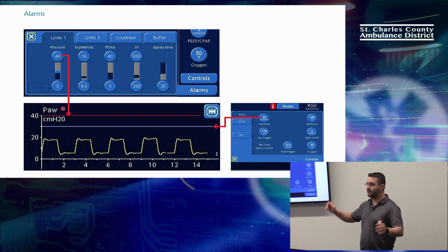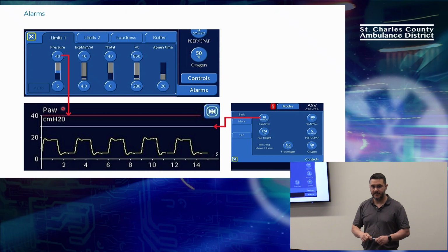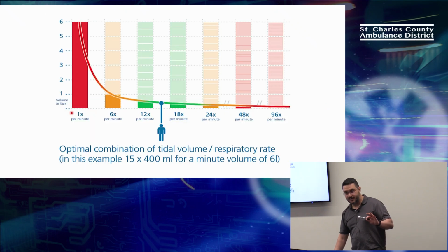And you're going to have to dust off the stuff that we covered a second ago and really program a ventilator, okay? So if the machine cannot give you the tidal volume that you want by getting to here, and it gets to here and it can't do that, that's when the machine quits. Does that make any sense right there? The machine will not be able to deliver and do this mode. I haven't shown you what the mode is yet. So I'm going to show you what that mode is.